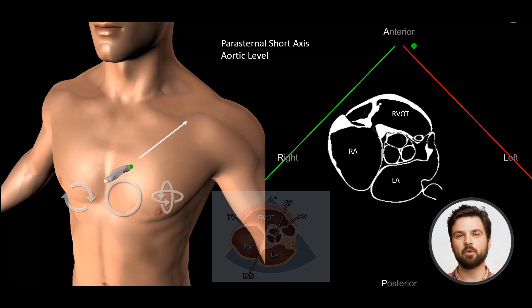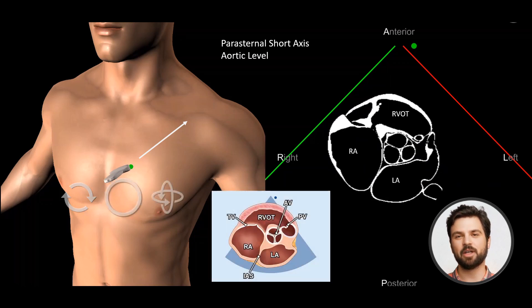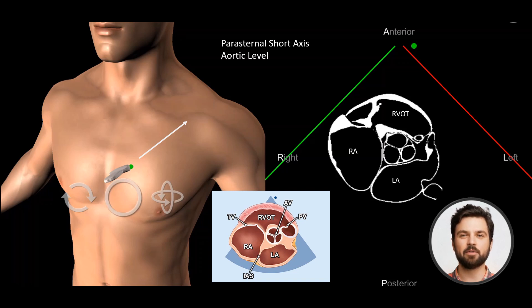The view that we see here is called the parasternal short axis view at the aortic level. The aortic valve is seen as a Mercedes-Benz sign at the center of the image.